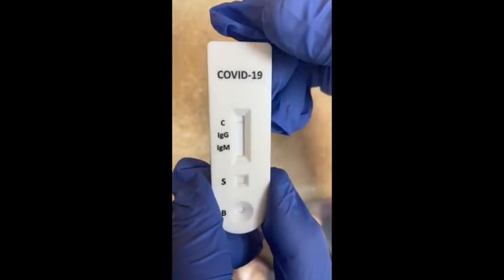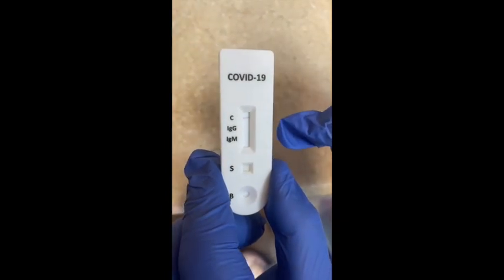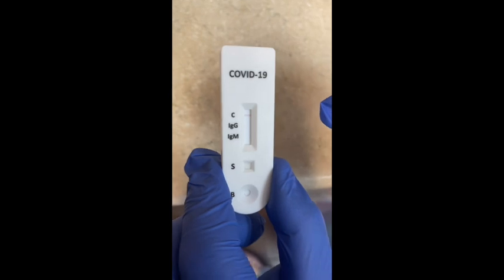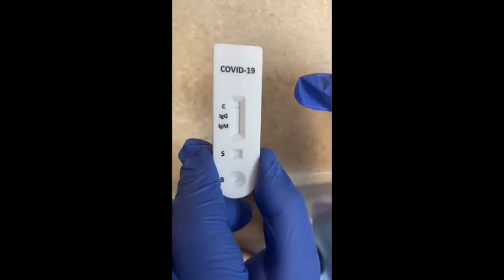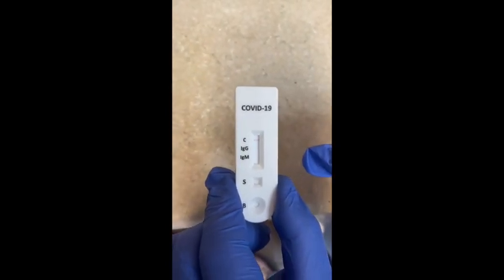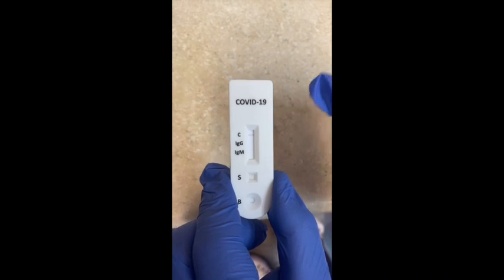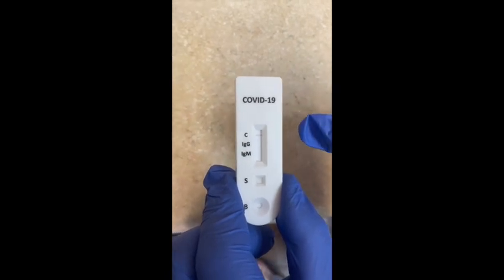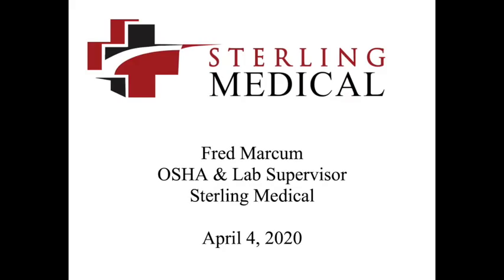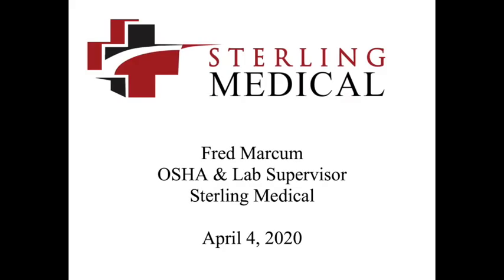If you have one of these other red lines and no control line, it's invalid — you must always have a control line. You can have a positive with all three lines present, or a positive with just two lines present. Go ahead and get your control line.